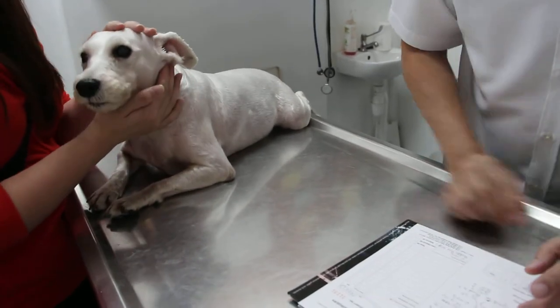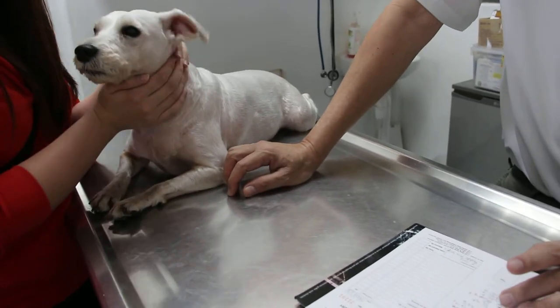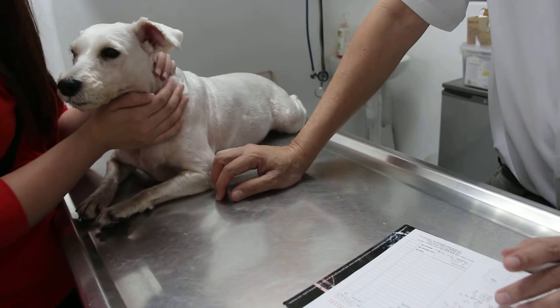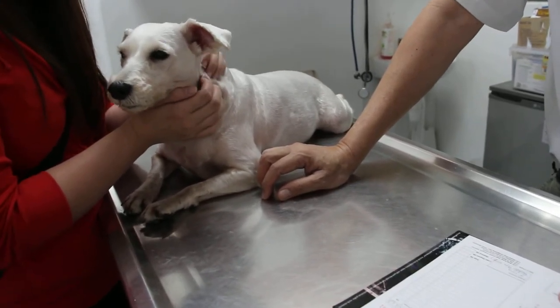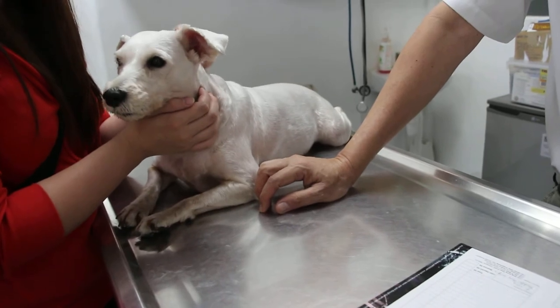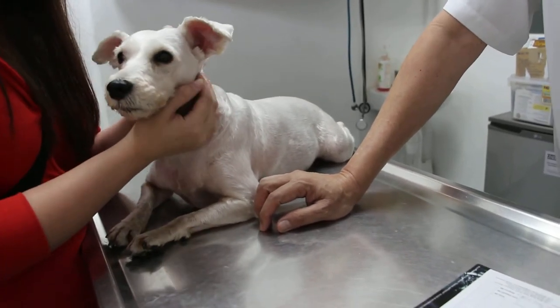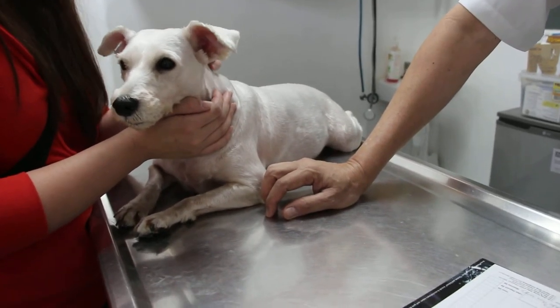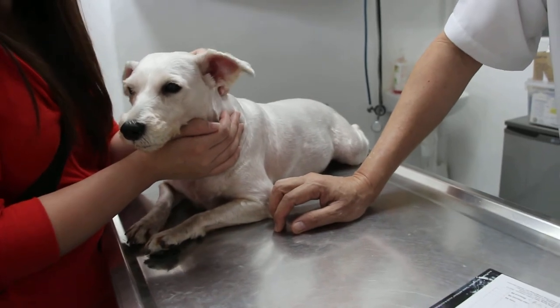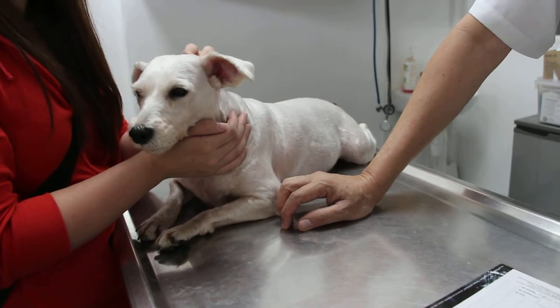So going back to the urine test: it shows blood 4+, a bit of white blood cells, red blood cells, and bacteria, but no crystals. In many cases the urine test shows no crystals but that does not mean there are no stones. In this case there are stones. The pH is about 7, so the stones are likely struvite stones. The purpose of the x-ray is to see whether there are any stones in the kidney as well, because even if you remove all the bladder stones, you still need to know whether there is a kidney stone.